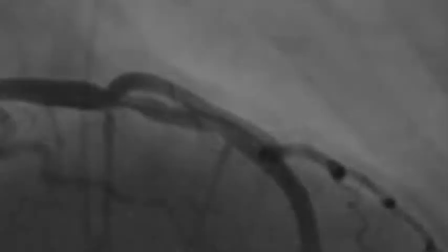So we treated her with aspirin and a statin at a relatively high dose, and blood pressure control, and there was really no other procedural management that I thought was warranted based on the negative findings from IVUS and the negative findings from the TVC imaging system.